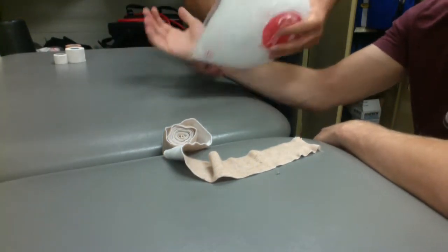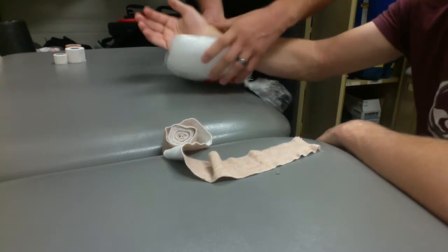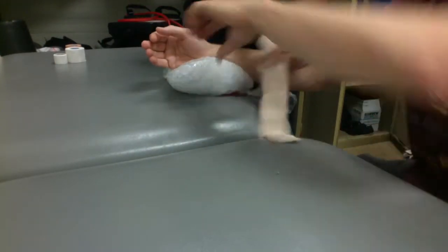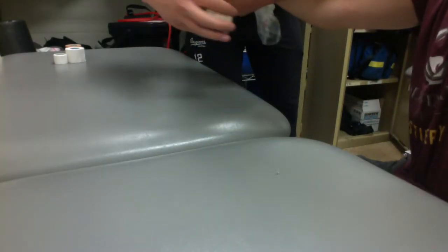Okay. So usually it's easy if you just rest on here. And I'm going to wrap it up so that it covers the entire structure. Do you want me to hold that for you? So yeah, lift it up, hold that there, and I'll wrap it up here. Got it? I think she's staying, yep.